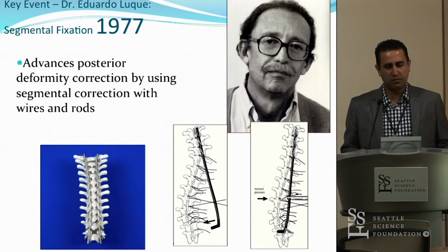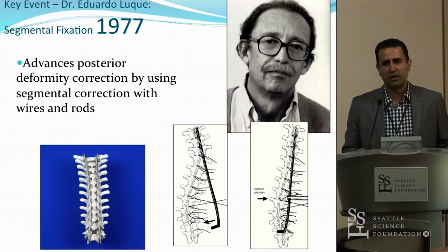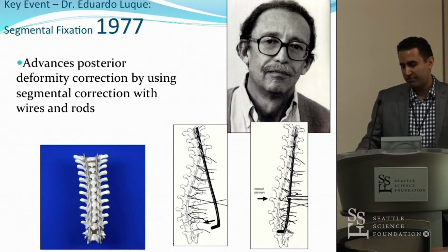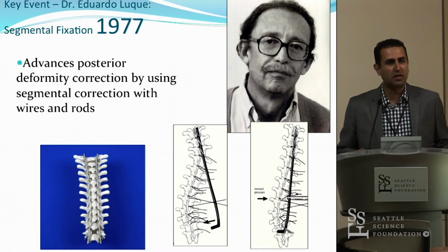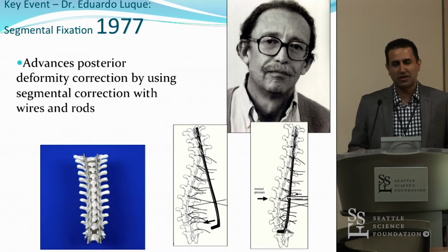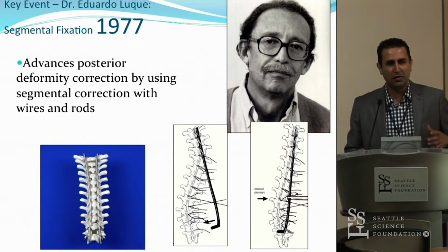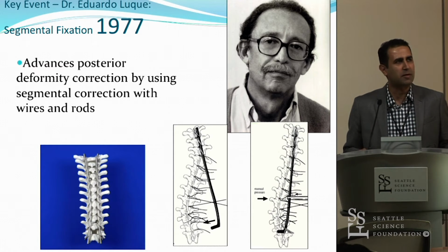But still, the challenge was rotational deformity, and they were still not able to quite address the rotational component of these major deformities. But Luque rods, I think you will probably see it in your practice at some point, particularly iliac stabilization, and to somebody like me who's never put them in, I would think it's a technical challenge, and the mastery is required to do that, with no connection and literally one rod that's bent from one iliac wing to the other up and down the thoracic spine.